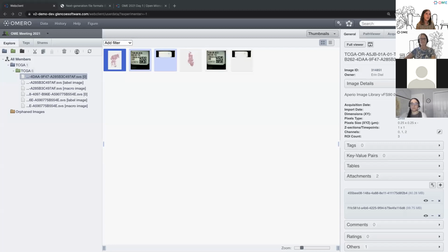And so what I'm going to share with you today, I wanted to generally speak about the derived data from our images, like segmentation and classification, and those segmented or classified objects, the measurements that we make of them and how we represent those in OMERO. And there's a few tools that I'm going to talk about that I think are either familiar to those of you who are using OMERO and things that might come up across the meeting and might have come up in previous OME meetings.